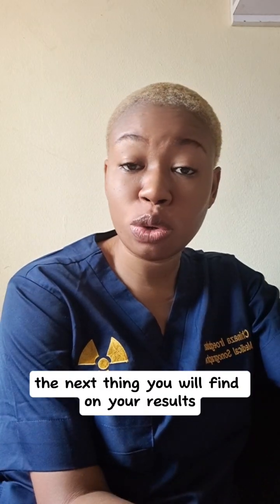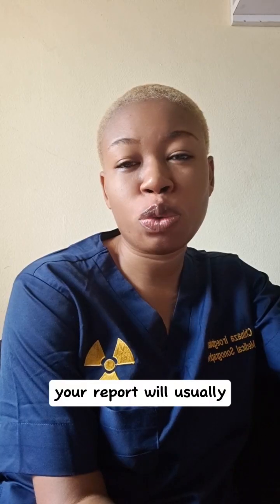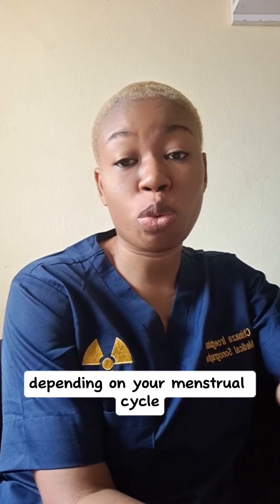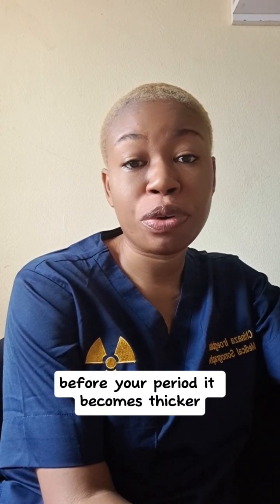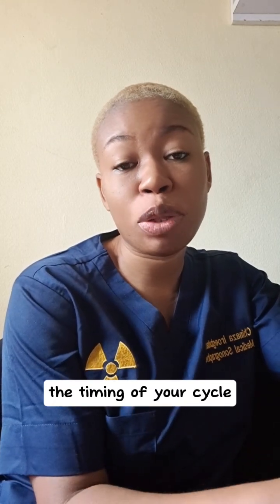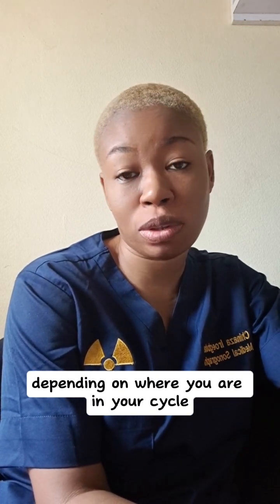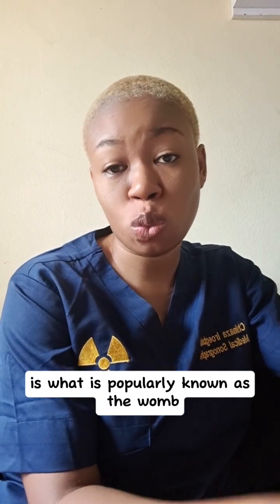The next thing you will find on your result is the endometrium, which is the lining of the uterus. Your report will usually include a measurement in centimeters or millimeters. Now, this is very important. This thickness changes depending on your menstrual cycle. After your period, it is usually thin. Before your period, it becomes thicker. So the number you see only makes sense when you consider the timing of your cycle, and that is why the timing matters. Pelvic scan findings can change depending on where you are in your cycle. What I have been calling the uterus is what is popularly known as the womb.